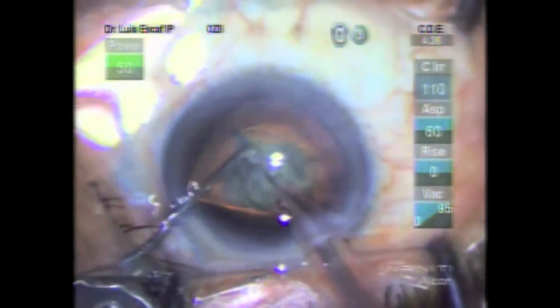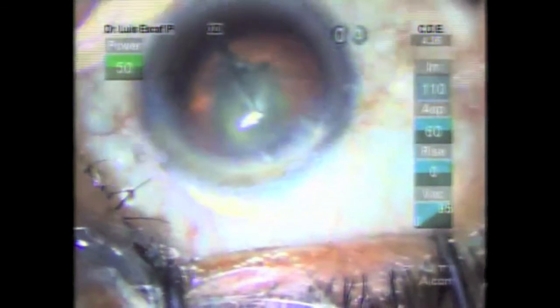In this case, we can see how the trypan blue flows through the groove.